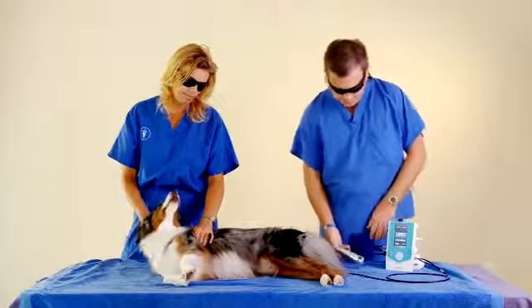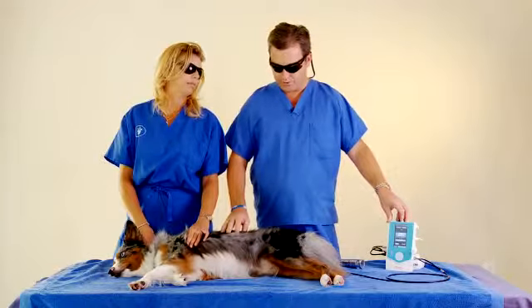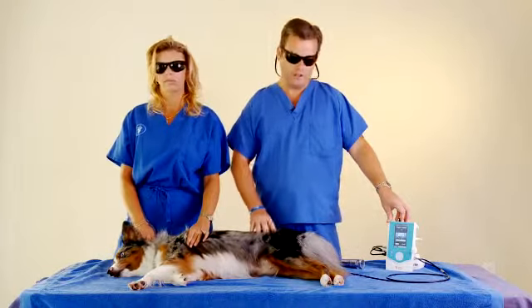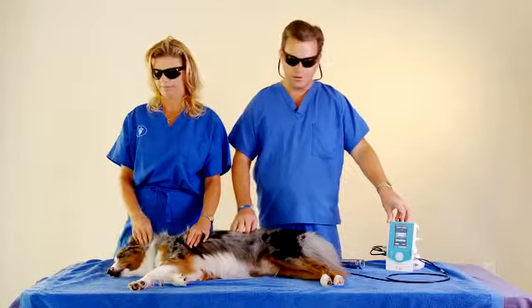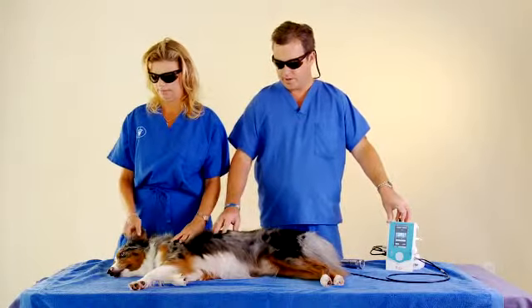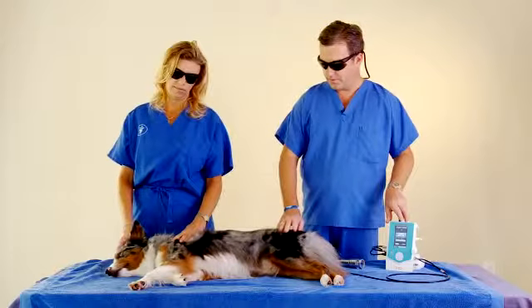Before I start, some things to consider when you're treating the animal is, first off, how many injuries and conditions they have. You can only put so much energy into the animal depending on their weight, age, and metabolic rate, and expect good results. So on a dog this size, you may be able to put in 1,500 to 2,000 joules at a max and expect the body to react well to the laser and to regenerate those cells faster.